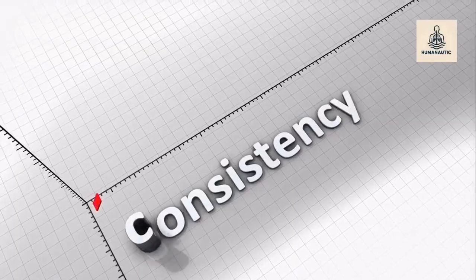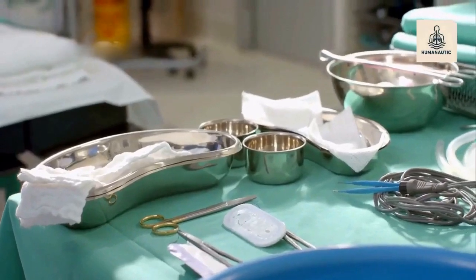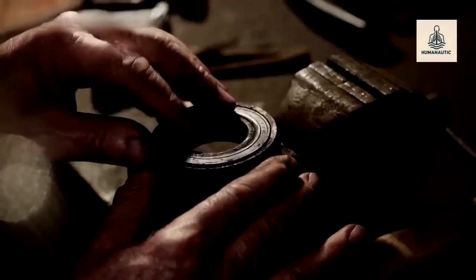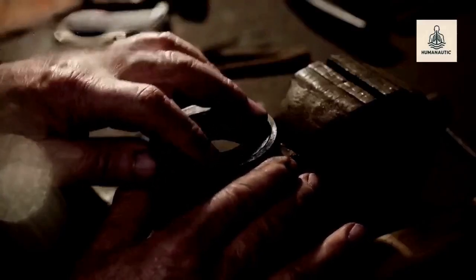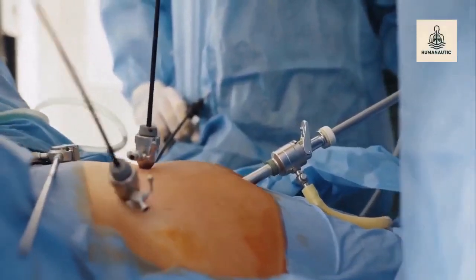This geometric setup provides stable visualization, ergonomic instrument movement, improved depth perception on the monitor. Students should also recognize the fulcrum effect. When instruments pivot at the port, internal motion is opposite to external hand movement. Mastering this concept is essential in laparoscopic coordination.